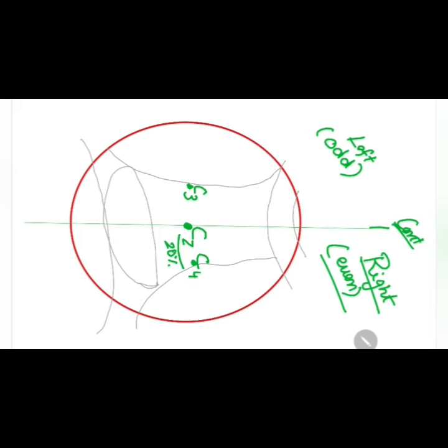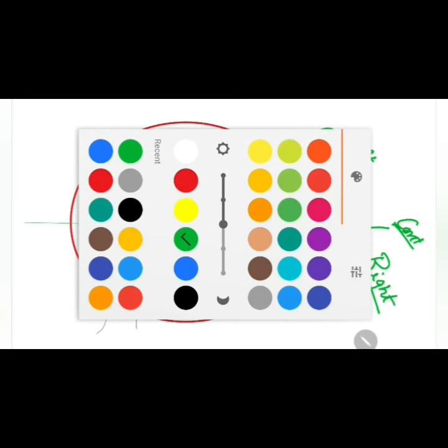Now let's move to front electrodes, FZ. Then on this side should be F4, another one electrode F. Now what should it be? F4. Should it be F6? No, it cannot be F6, it should be F8, again because of the 20% difference. Similarly on the left side, F3, F7, right?